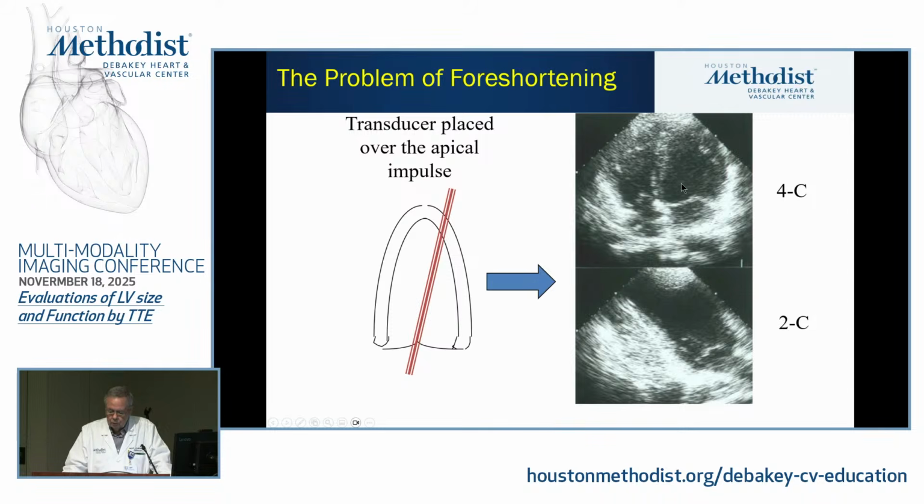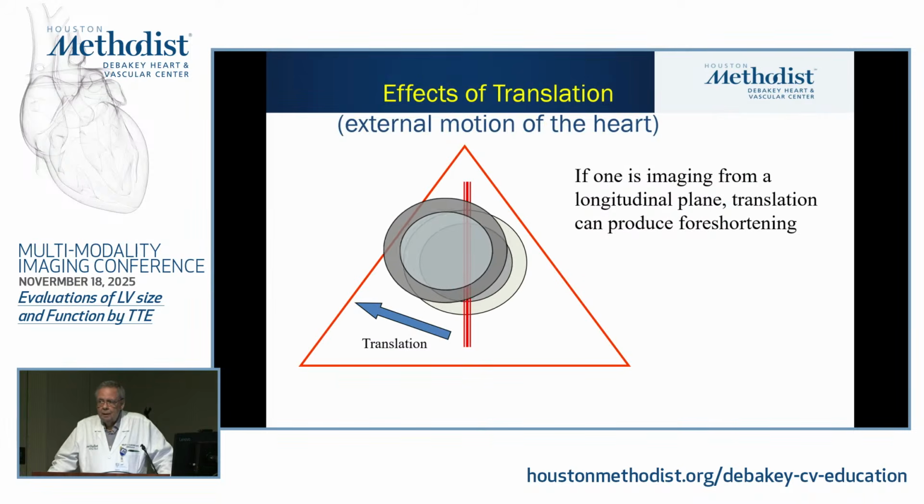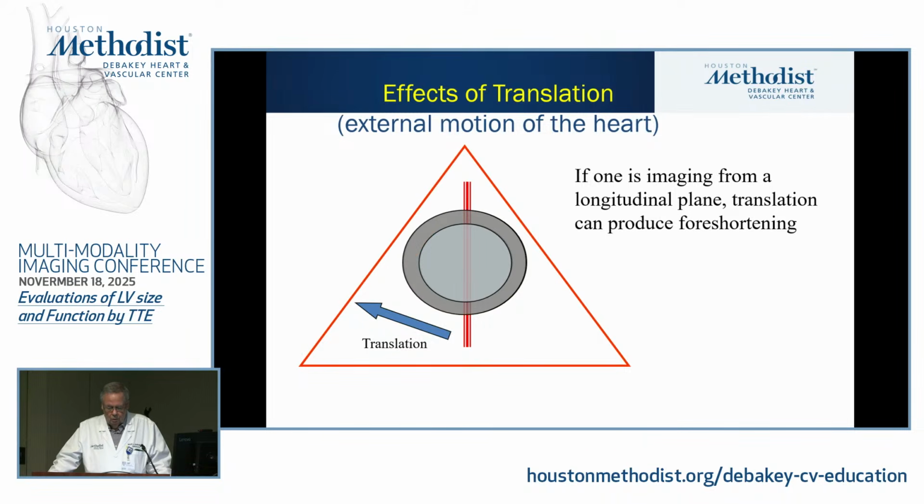So you end up with a smaller heart, but it can often look like it's contracting much better because once again, you are making that cavity smaller, and the same amount of movement of the walls makes the appearance of a better ejection fraction. And this is the worst, because this one has almost no solution other than paying attention to the short axis view.